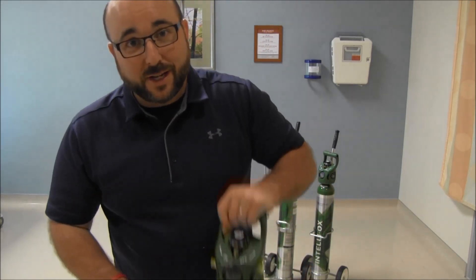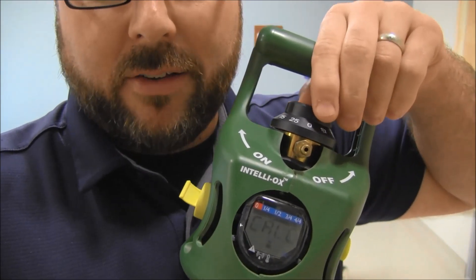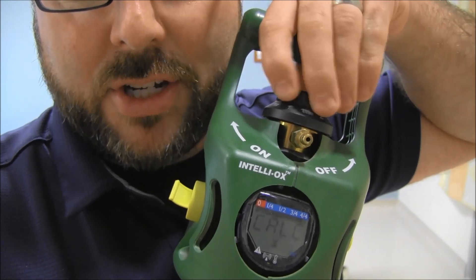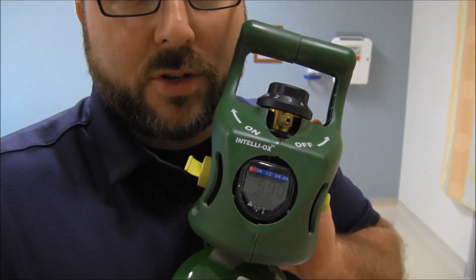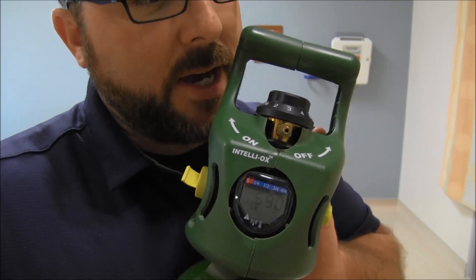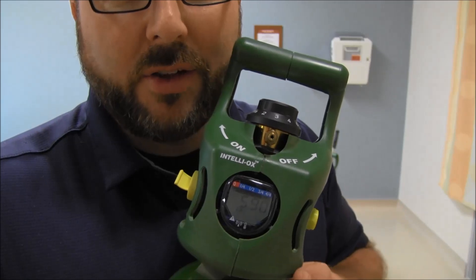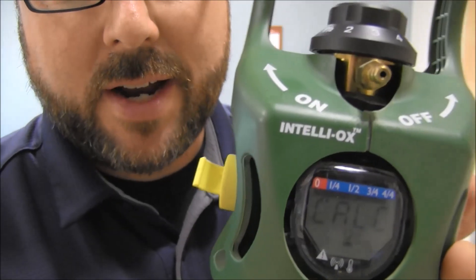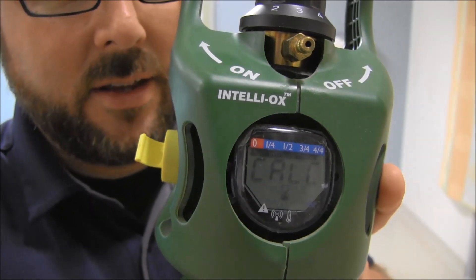Here is the really cool part for patient safety — this is a smart gauge. I'm going to put my patient on three liters of oxygen. Right now it shows 590 liters. I just turned on three liters of oxygen — watch what the tank does. Getting my patient ready on the cot, and you can see what this thing is doing: it says 'calc' — it's calculating duration, figuring out how long this tank will last at the current flow.